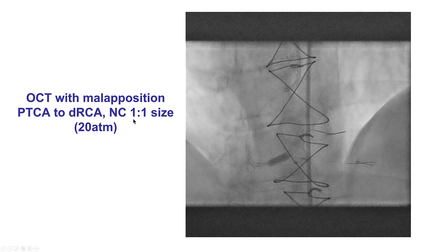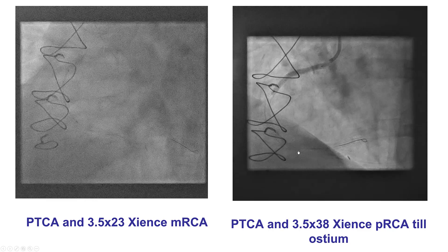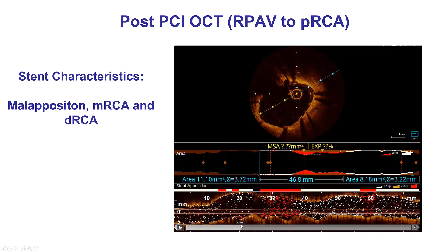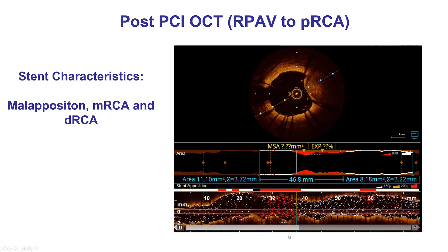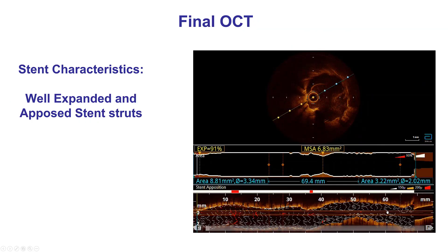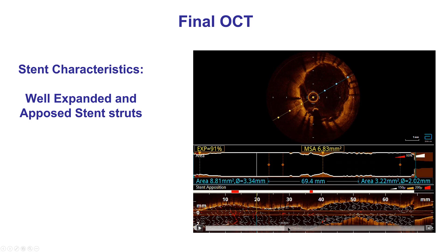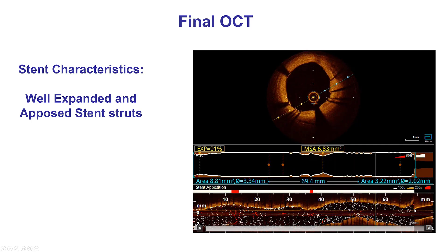We used a larger balloon and performed high-pressure inflation in the distal RCA, then stented all the way to the ostium of the native right coronary artery. A repeat OCT coming from the posterolateral showed the posterolateral was well covered with stent. Coming back more proximally, there were again areas of stent under-expansion, some stent overlap, and further under-expansion higher up — so additional post-dilations were performed. At the end, we had a nice result: areas of red are minimal on the final image, and we achieved good stent expansion and stent strut apposition all the way to the ostium of the native right coronary artery.